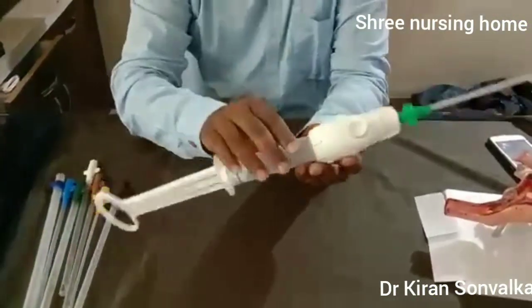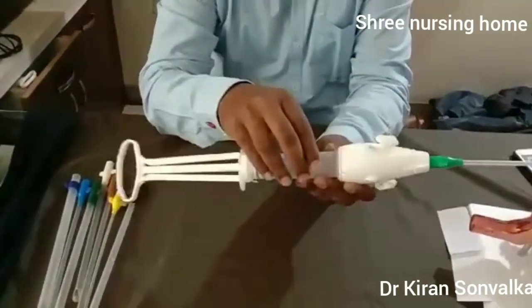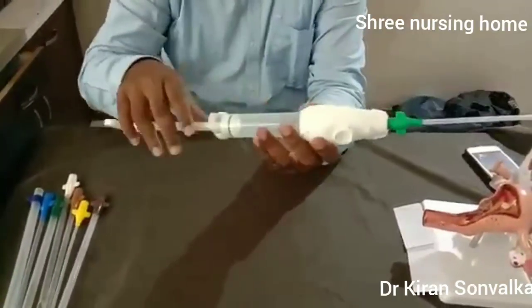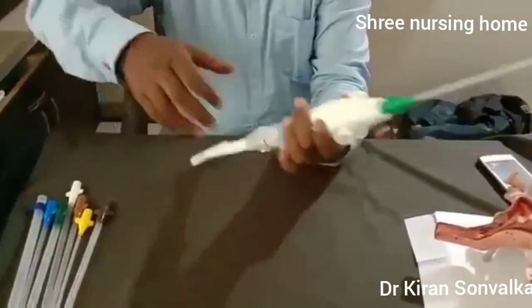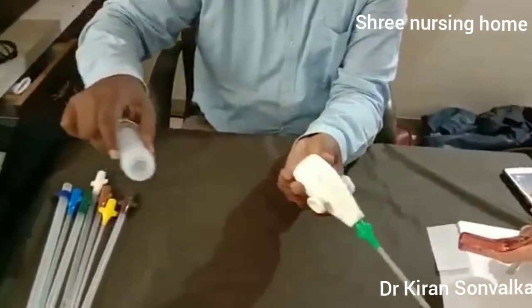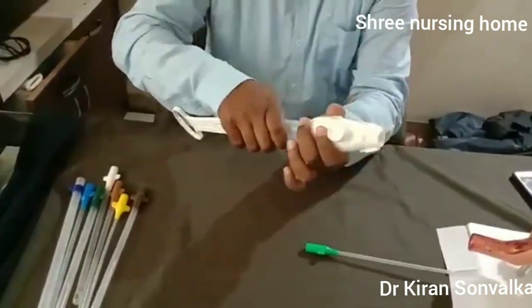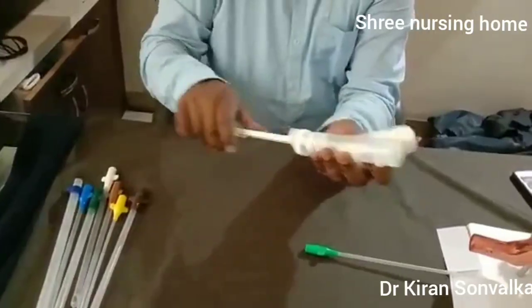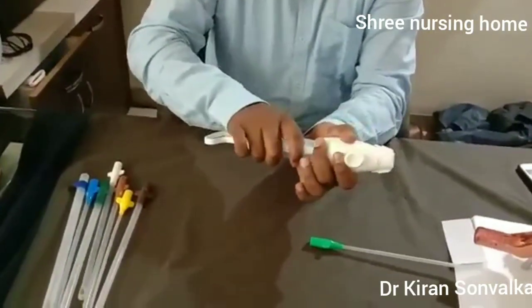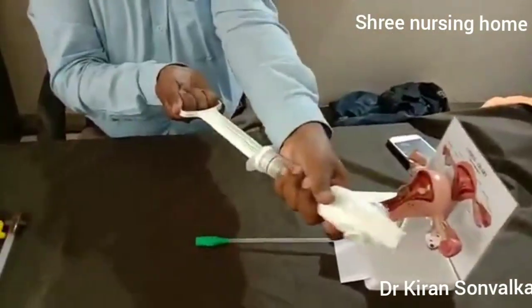Take care while holding the syringe — don't hold the plunger; hold near the cylinder or near the valve. Once removed, empty the product of conception into the dustbin. Then put the plunger inside once again to create the vacuum.